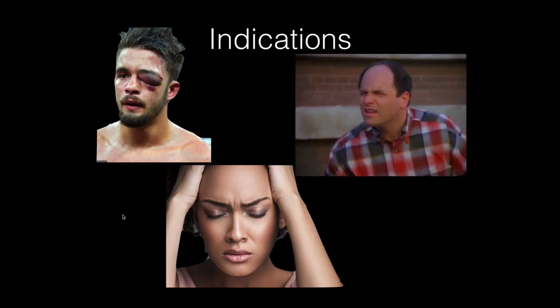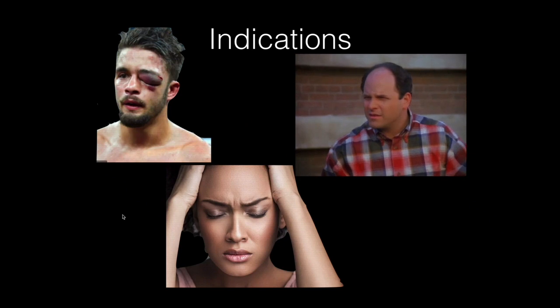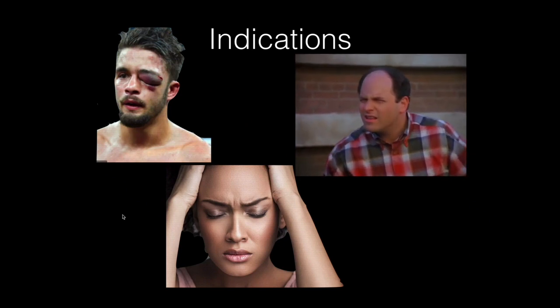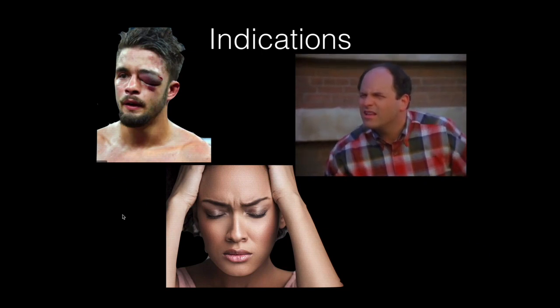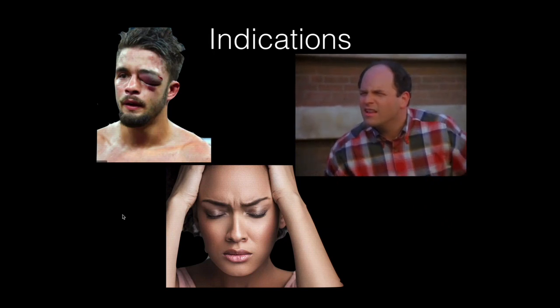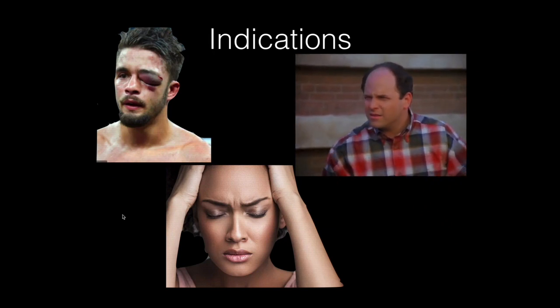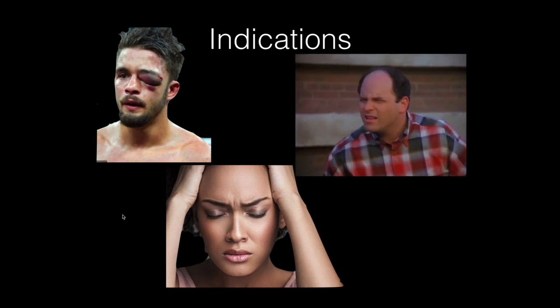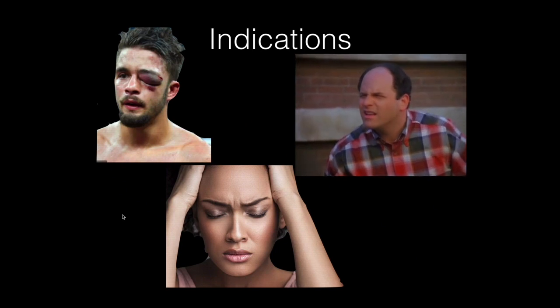Potentially at some point the eye might be so swollen shut you can't check pupillary reflex or ocular movements, and trauma patients are a good group that you can scan to look at these things. You can also consider it in patients of altered mental status who can't really tell you much about their vision, and when your history and your exam is leaving you without a definitive plan or diagnosis, something else to consider.